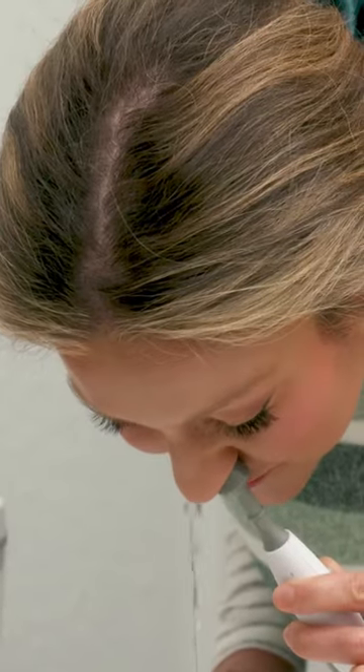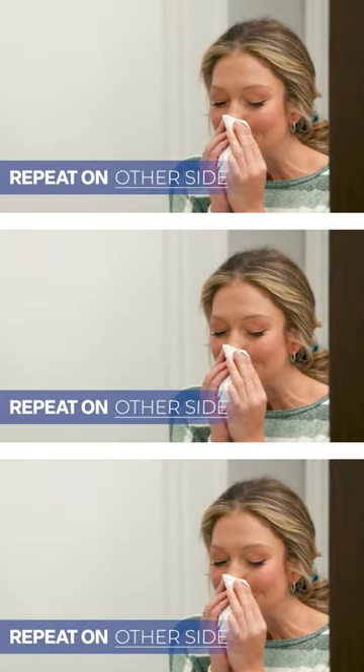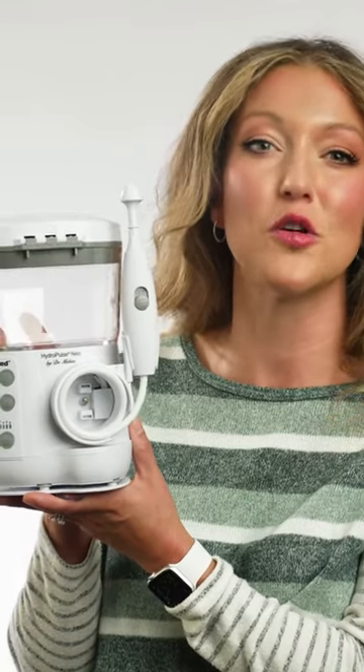Place the tip in your nostril and start the flow. The water should drain out the other nostril. Remember, in one side and out the other. Gently blow your nose and repeat on the other side. The NealMed HydroPulse Neo is perfect for ongoing sinus rinse needs.